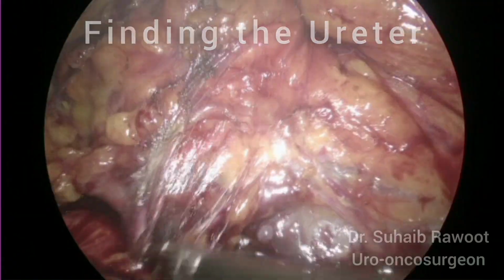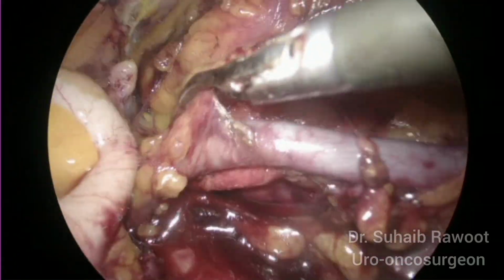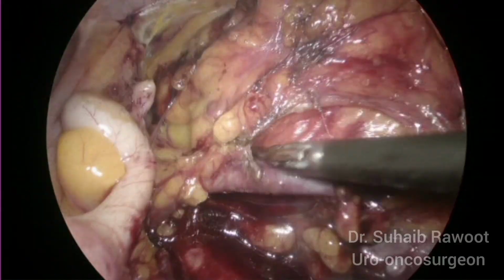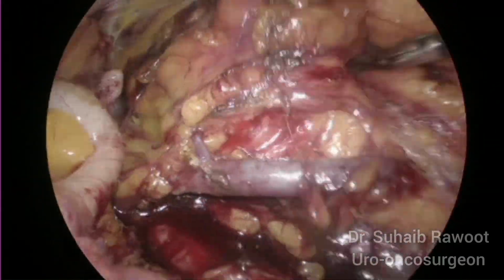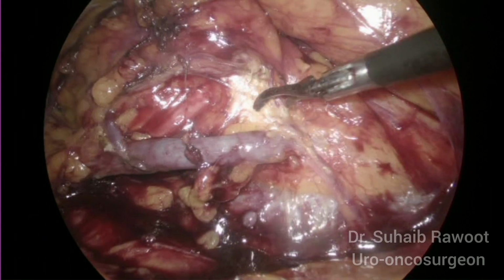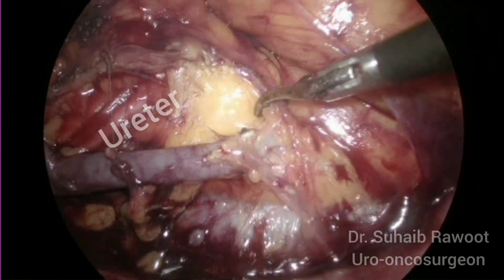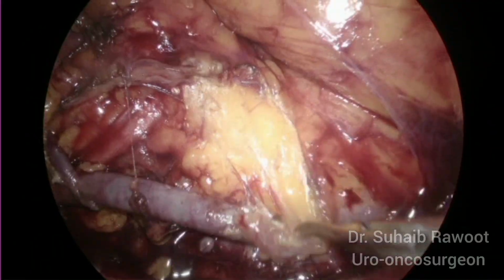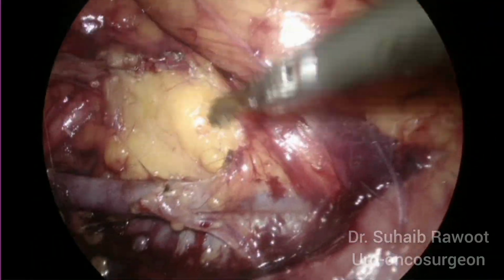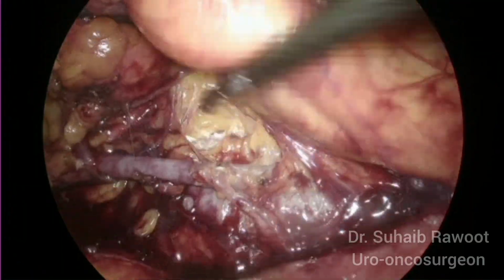This is the right gonadal vein and you will find the ureter just behind it. As you can see, as I am dropping it down, the ureter is visible. Once you identify the ureter, you have to make a plane between the ureter and the psoas muscle and lift the ureter upwards. So we have to keep lifting the ureter upwards until we see the psoas muscle laterally.